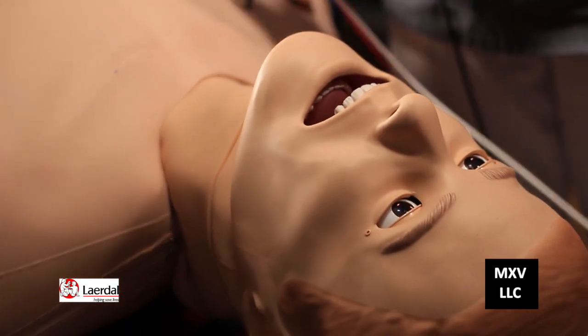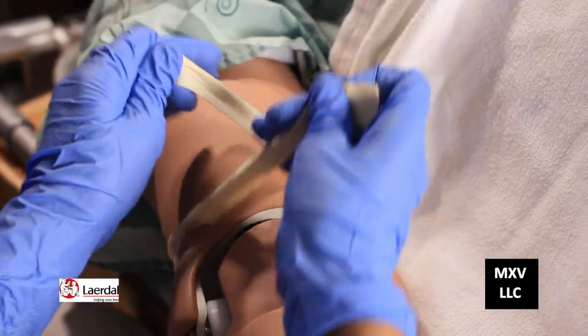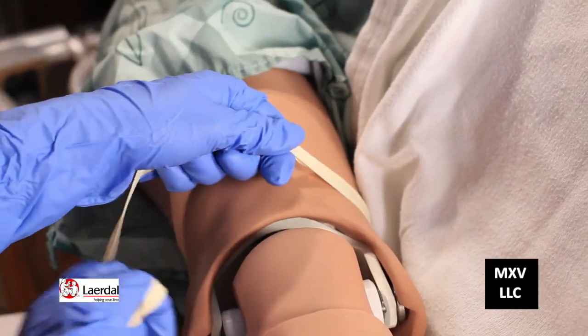We're ready to draw the blood. I'm going to introduce myself to the patient. Mr. Marlboro, my name's Holly and this is my instructor Rebecca, and we're going to draw some blood today. How are you feeling? The patient responds: I should have quit smoking. We're going to take care of you today. The first thing I'm going to do is apply the tourniquet to the upper arm. You can go lower sometimes if you'd like, and do a quick release.